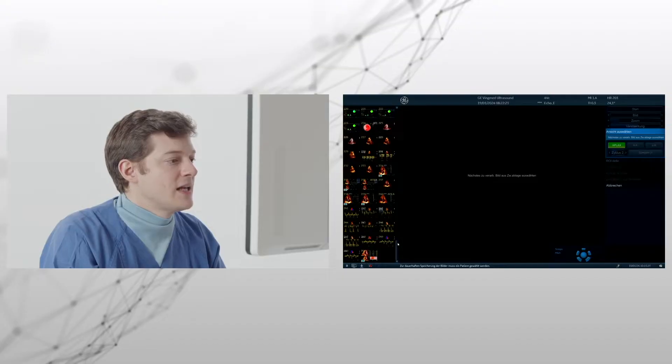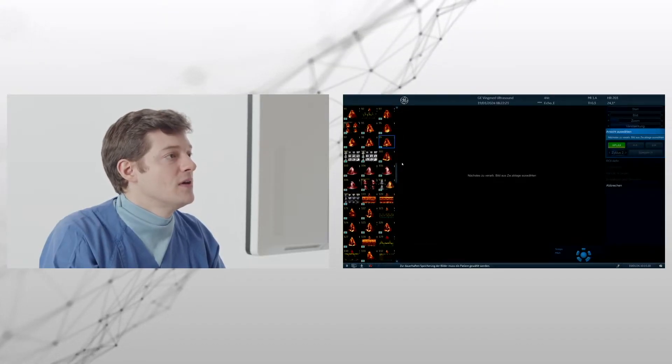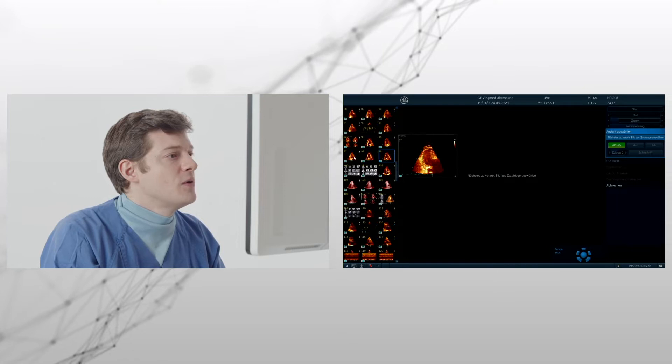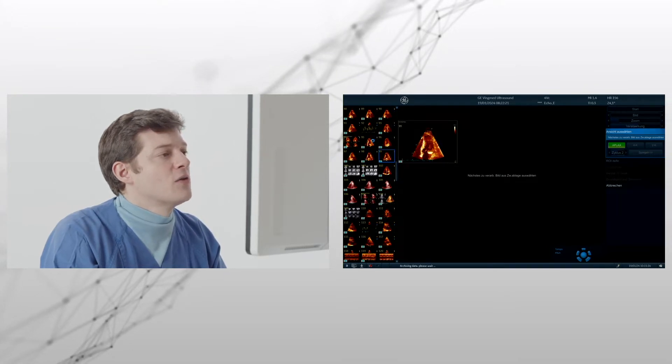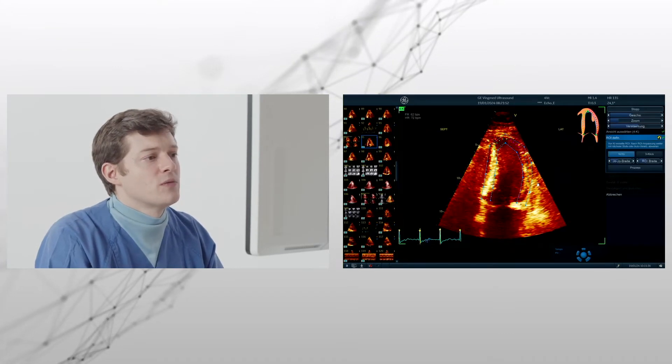And now it tells us we have to find our own loops because we, of course, started a little bit unconventionally. And now we use the four chamber view.